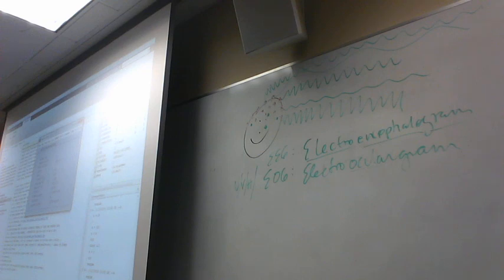How many times something occurs per second? Exactly. So if we have this trace of electrical activity, let's say that this is 1 second in time. Everything in this class we're going to be talking about time, 0 to 1 second. It means how many times does this signal make a full revolution in 1 second? This is a very slow one. This is a very fast one. It's basically sine waves.